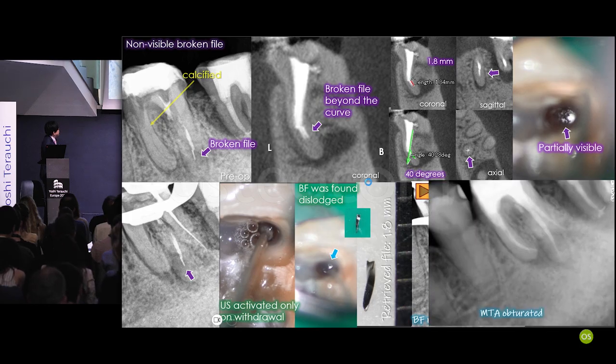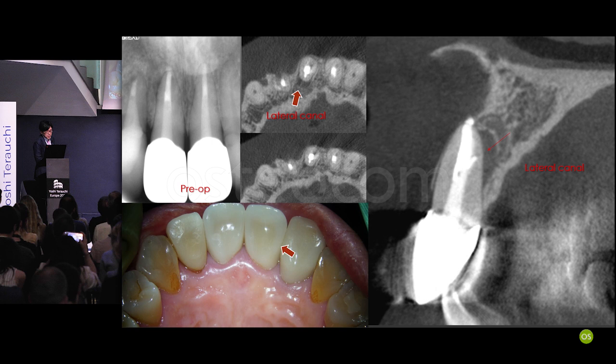And this is immediate post-op. Because of my accuracy, I didn't sacrifice lots of dentin to remove the broken instrument. And this is immediate post-op. Of course, I obturated the canals with MTA.